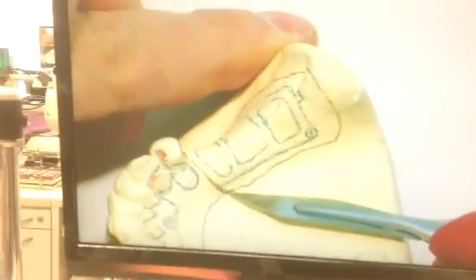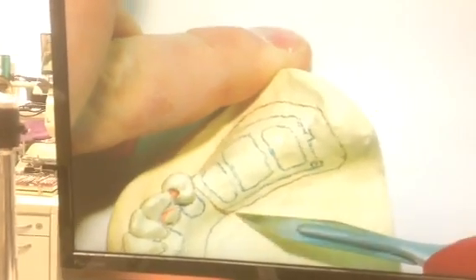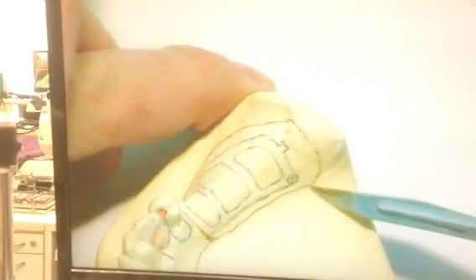Acrylic meets the framework at a butt joint. Acrylic goes all the way down to the vestibule. And I question, because this cast, I pulled it out of his drawer over here. I doubt that this is his drawing. Number one, it's a little sketchy.